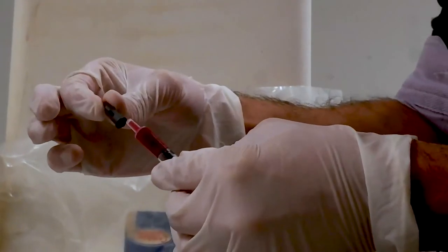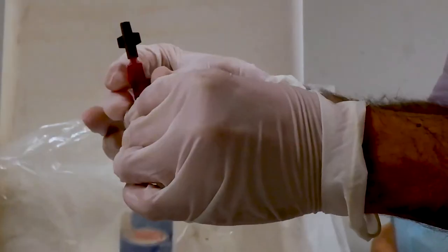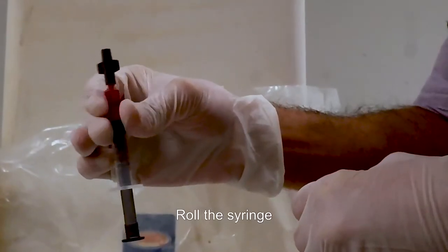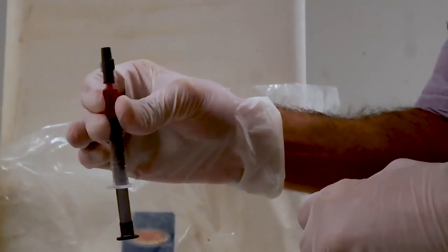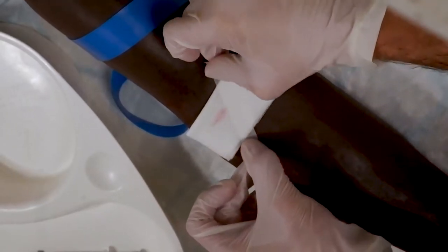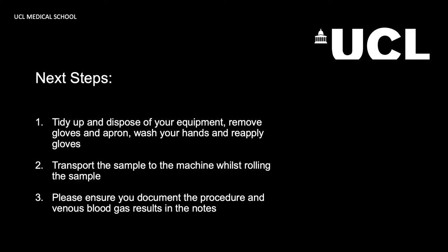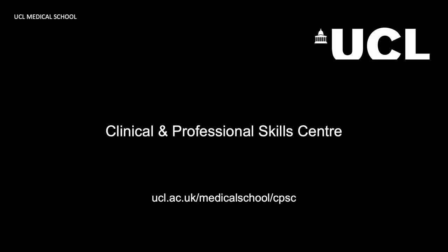Apply the bung to the syringe and roll gently within the fingers to reduce the risk of clotting. Apply an appropriate dressing to the site. Please ensure you document the procedure and venous blood gas results in the notes.